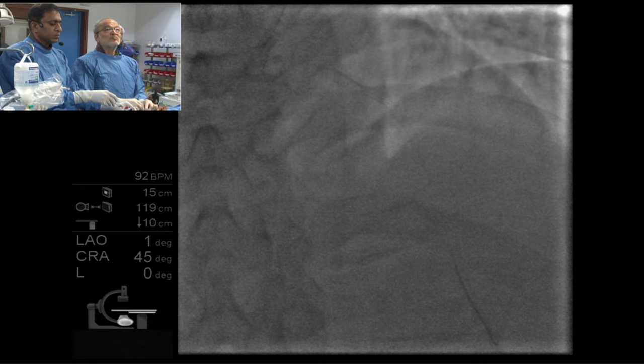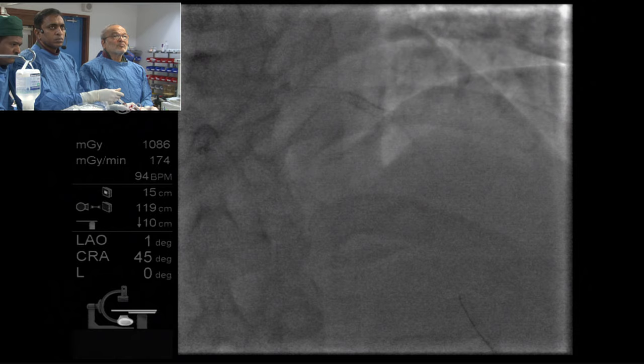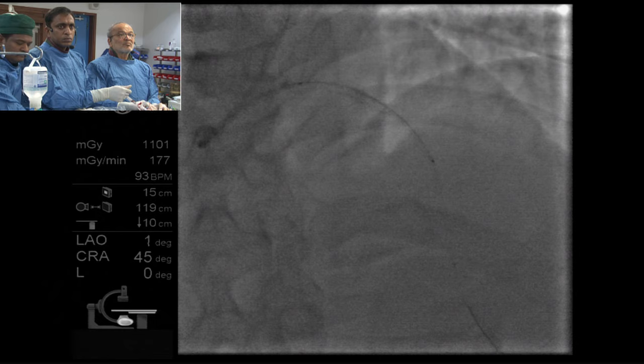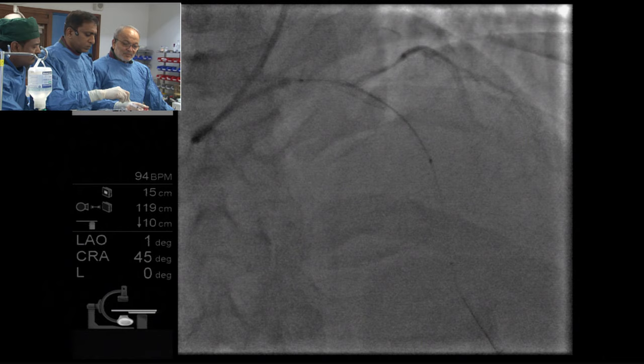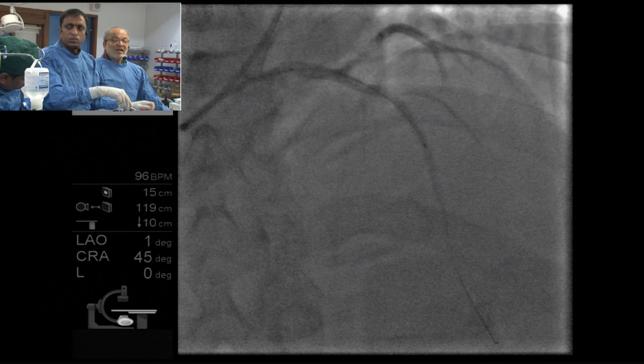John, you guys did the trial with Avandia. Did you find any improvement with insulin sensitizers on subsequent restenosis? No, not at all. Okay. We are in the OCT. What about brachytherapy in such cases? Yeah, with more than two layers, a stent is undesirable. So if you re-restenose, then okay. I think brachy is a good option. Ready?